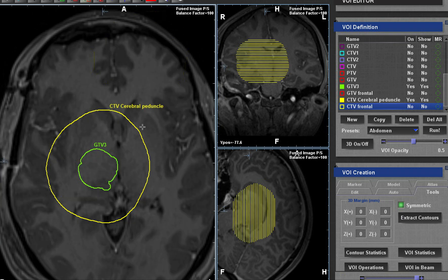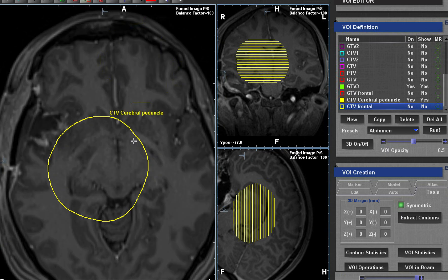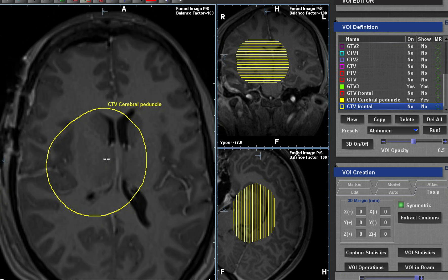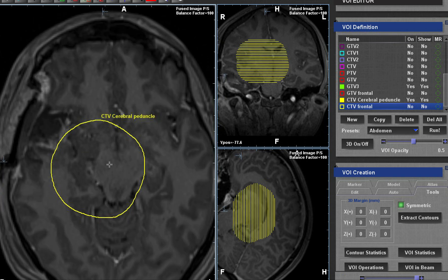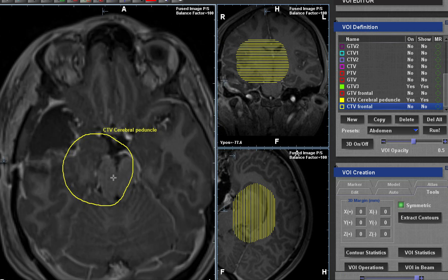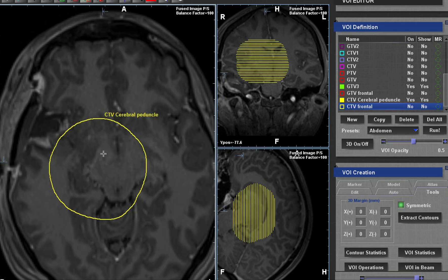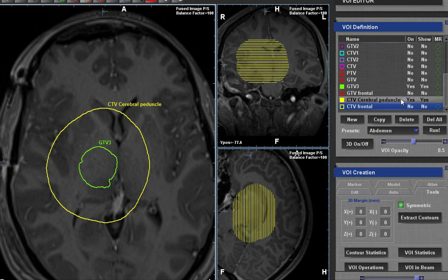As discussed in the previous lecture, I will show you a few points we covered. For example, if you have a lesion in the thalamus, I told you we don't trim our CTV to the cerebral peduncle. The cerebral peduncle is the anterior part of the midbrain. If you put your cursor at the cerebral peduncle and go up, this will lead you to the thalamus.